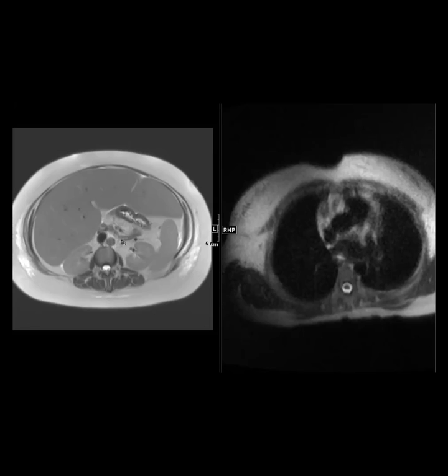I have it as a case in my teaching file, but I was not able to find anything in the literature about that change in the extramedullary component of the bone marrow elements. Has anybody seen anything like that? I could see that, or even brown fat proliferation in the fatty part. It was all fat, but it was double. It went to resection because the surgeon was not comfortable leaving a significantly growing fatty lesion. Path showed a myelolipoma, but cool.